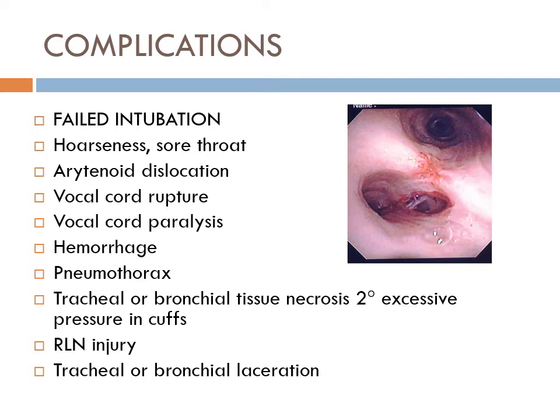So if I look at this picture right now, I first want to orientate myself. I'm looking at where's left, where's right in the lung. You know that the lungs go from the trachea to the carina, we have the landmark, we have the right and we have the left main bronchus, right? But if you were to go past the carina, you have additional offshoots. You have the right upper lobe, the middle lobe, the right lower lobe, you have the left upper, left lower. Those are also going to have branches that look like carina. So it's not just as easy as remembering, well, left's right, left's left, right's right.